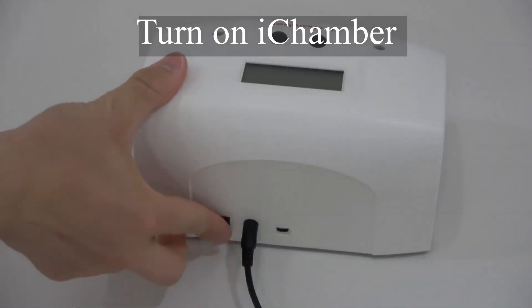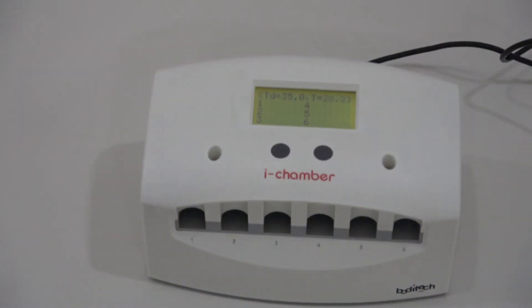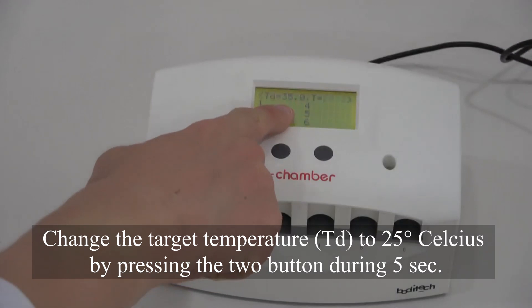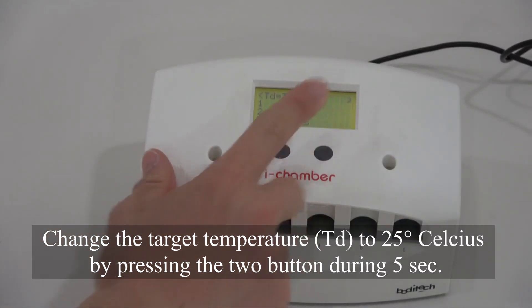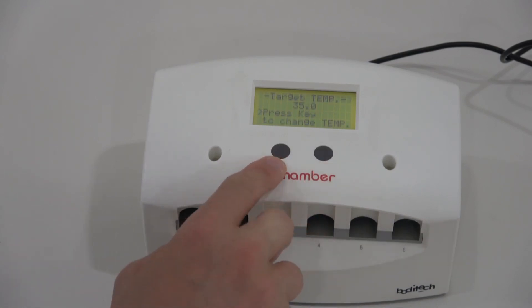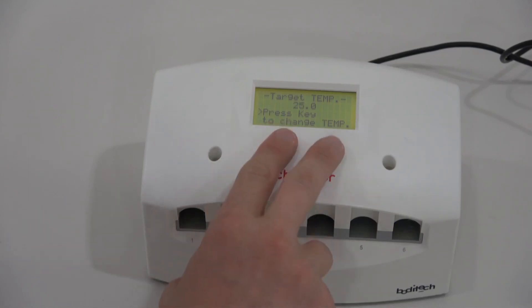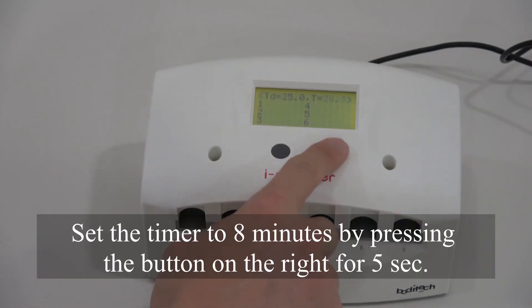Turn on iChamber. Change the target temperature to 25 degrees Celsius by pressing the two buttons for 5 seconds. Set the timer to 8 minutes by pressing the button on the right for 5 seconds.